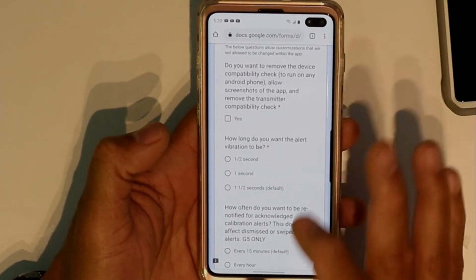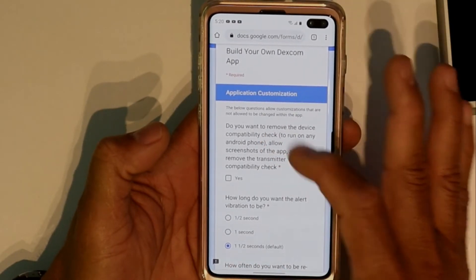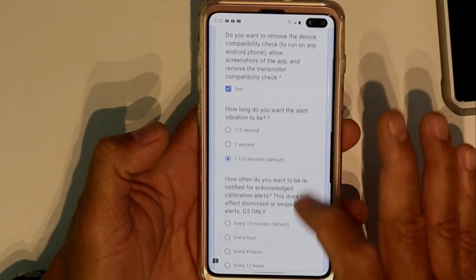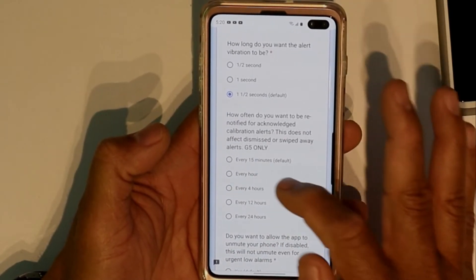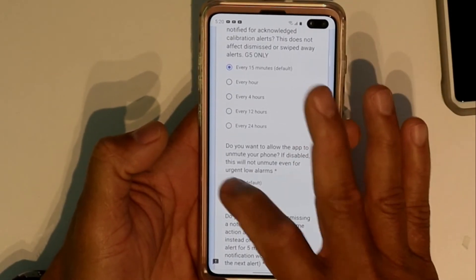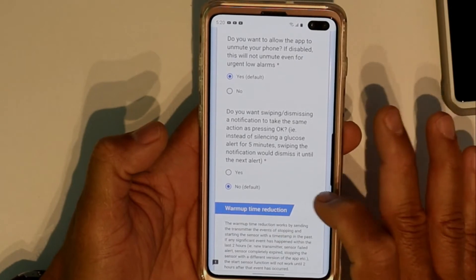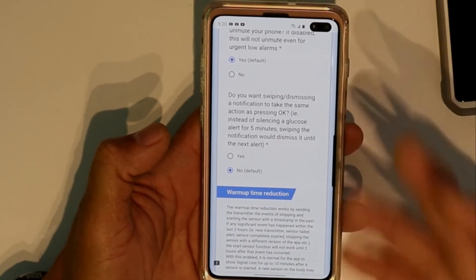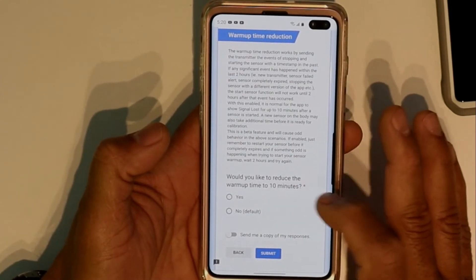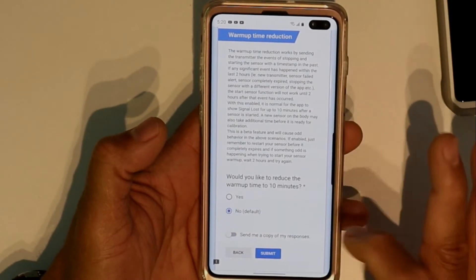It's going to start asking you some questions — which unit do you prefer? I'm going to go with MG and click next. For the Customize section, I just go with default. You want to remove the compatibility check — click yes. For the every-15-minutes option, click check here. I just do default on all of them — you can read through and decide what you want.